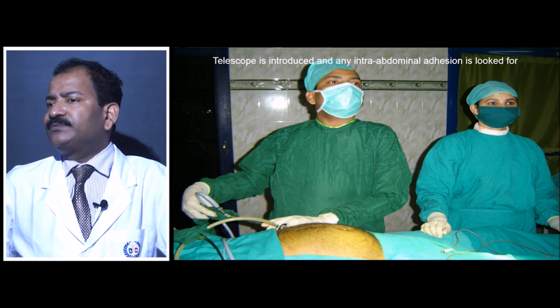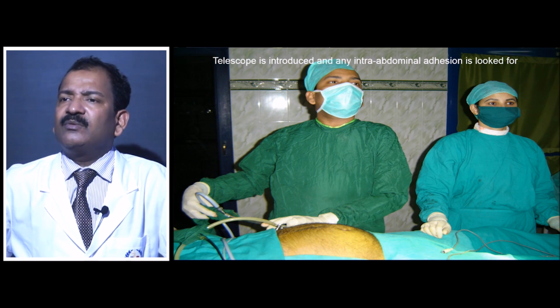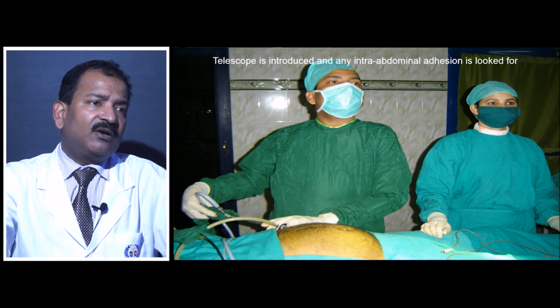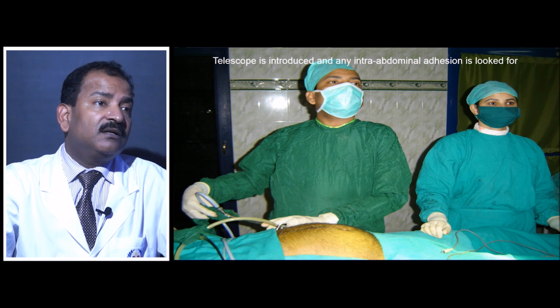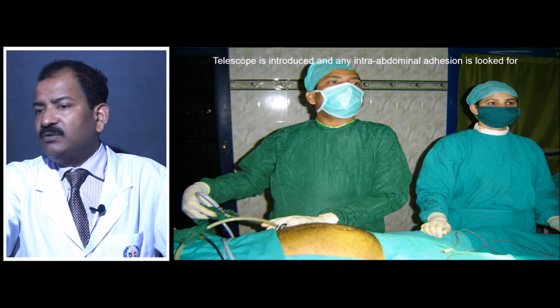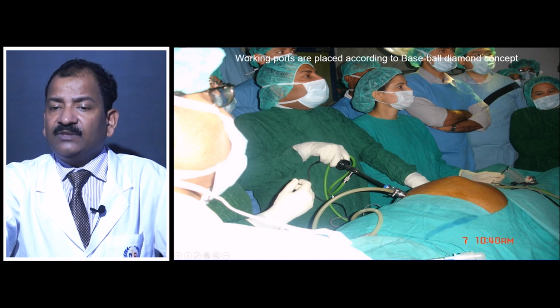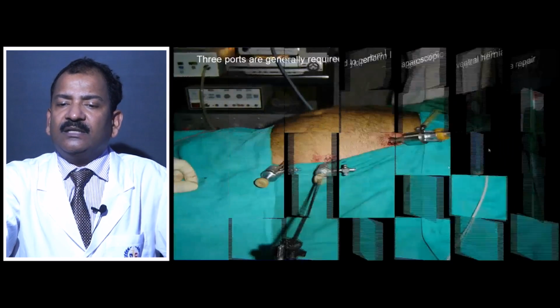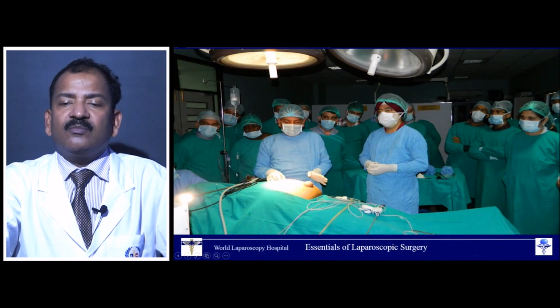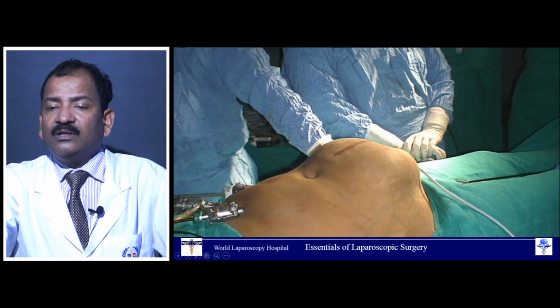Another important thing is that if you are a gynecologist, simple surgery like simple ovarian drilling and all, you can continue from Palmer's point itself, but TLH and the like you will not be able to do, because you cannot see the vault, you are far away. So, in those situations you have to use it only for access. The light cable should be down. If you are doing ventral hernia, then you can do it by putting in two other ports, and you can perform almost all types of hernia this way, even the huge hernias.